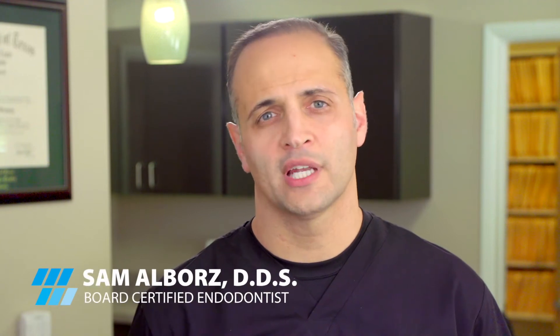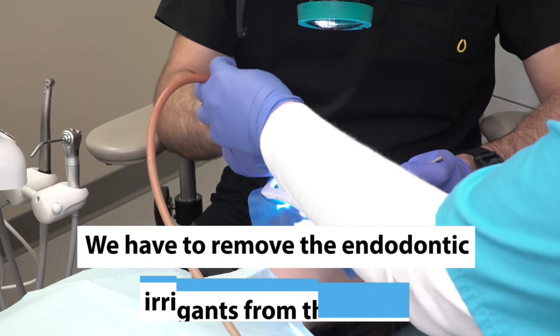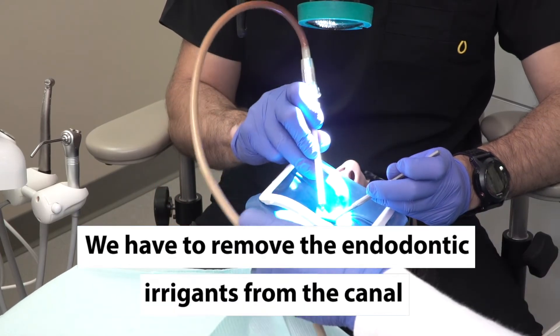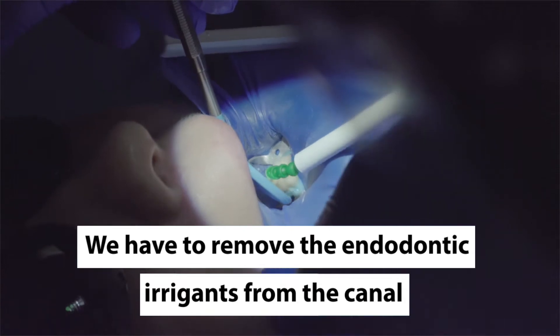Once we are done with our irrigation regimen, drying of the canals is very important, mainly because we have to remove the endodontic irrigants from the canal, as they can be a source of irritation for the tissues surrounding the tooth.